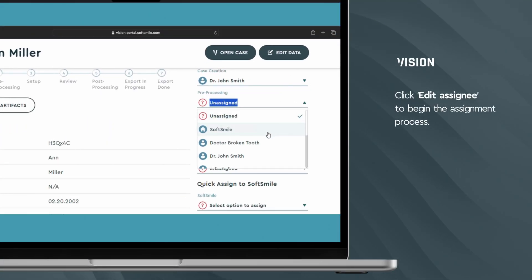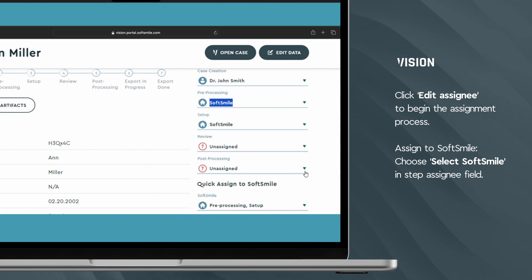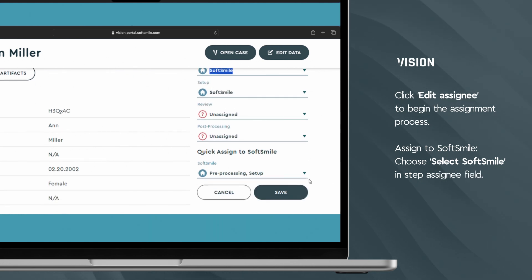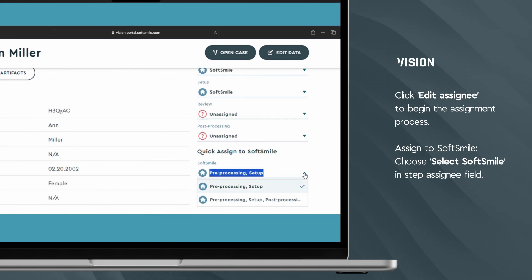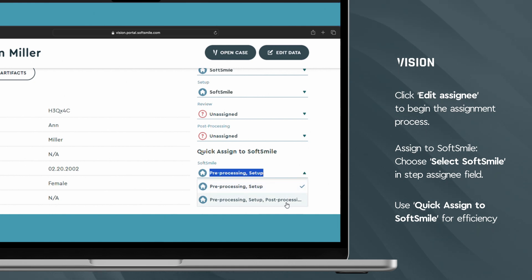You have two straightforward options to assign to SoftSmile. Select SoftSmile directly in the Step Assignee field, or use the Quick Assign feature for even faster processing.